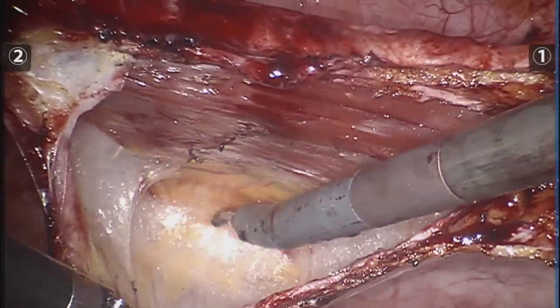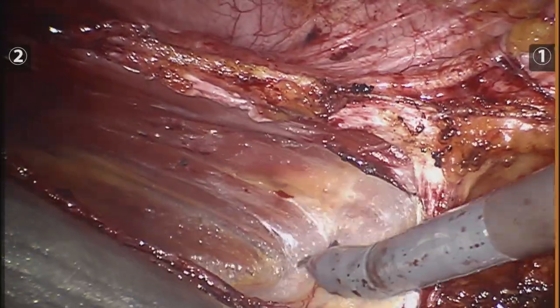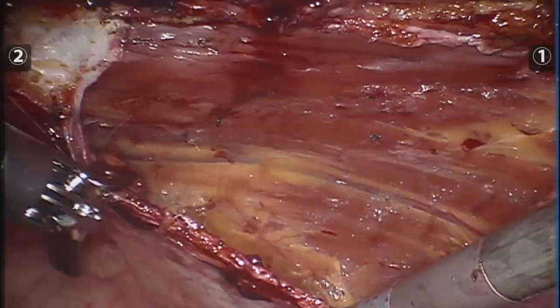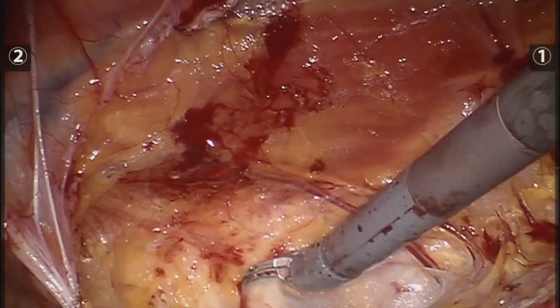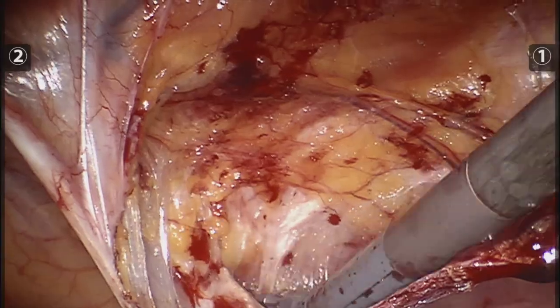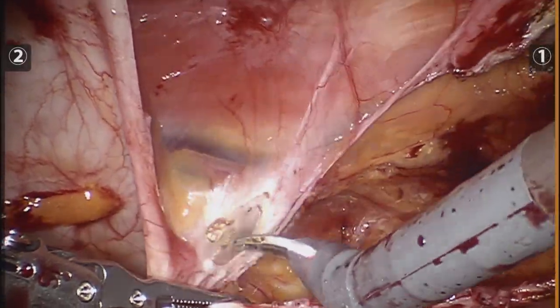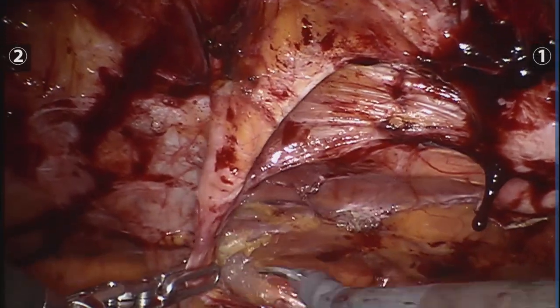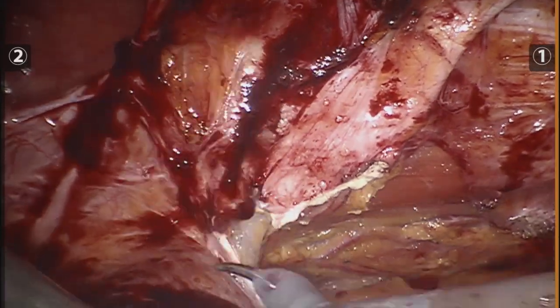During the procedure I had in my mind all the videos and comments I have heard from professors like Dr. Conrad Ballester, Dr. Igor Veliansky, Professor Moissoms, and really the IHC and all the videos and posts we get from all of you — that really made a big difference for me in this being my first case. This is my first robotic case, but I've done this laparoscopically and in the open fashion. Having done open and laparoscopic TAR gave me a good advantage in terms of knowing the anatomy and knowing what I was going to be facing.